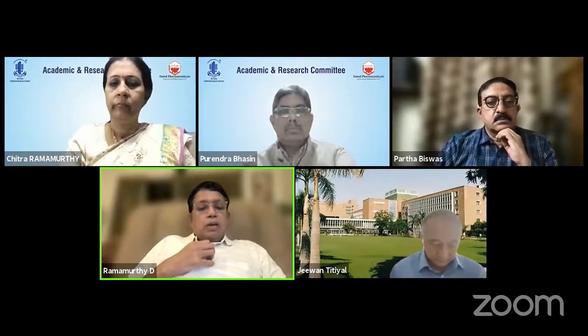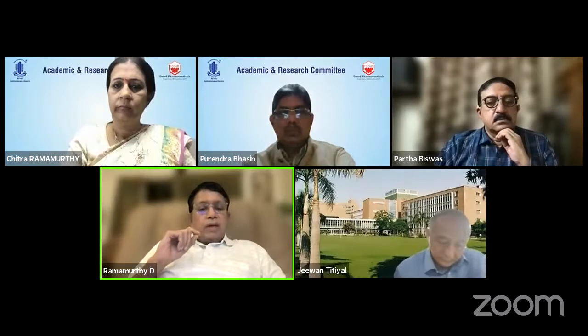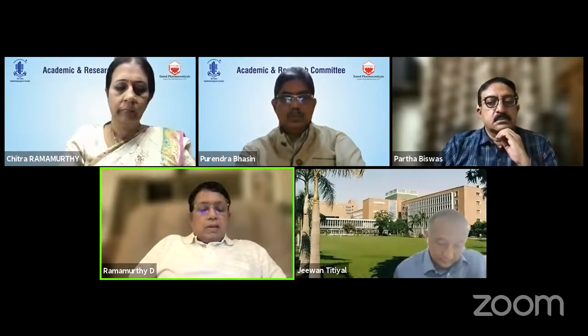Second thing is about the quality of vision. Even though we have so many different nomograms in laser vision correction, there's always a certain drop in the quality of vision when we go on to higher amounts of refractive error, both hyperopia and myopia. So if that matters a lot to the patient, again, I tend to go for phakic intraocular lenses because there's no distortion of the cornea that you get with a phakic intraocular lens.